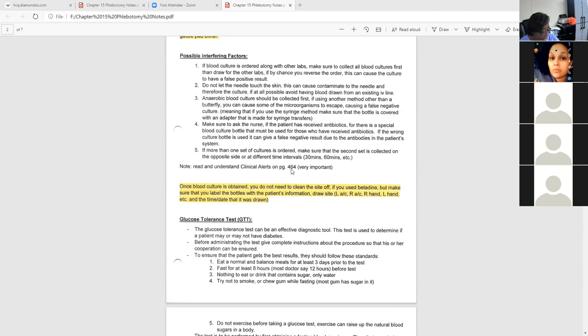where it says for any blood collection procedure, the venipuncture site must not be repalpated after it has been cleaned for a blood culture. Because once you sterilize it, blood culture is like surgery. Once that area is sterile, we cannot retouch it because then we have to start the process all over again, scrubbing for one whole minute all over again. So once we disinfect it, that's it. Can't touch, don't touch, cannot touch. It's a done deal.